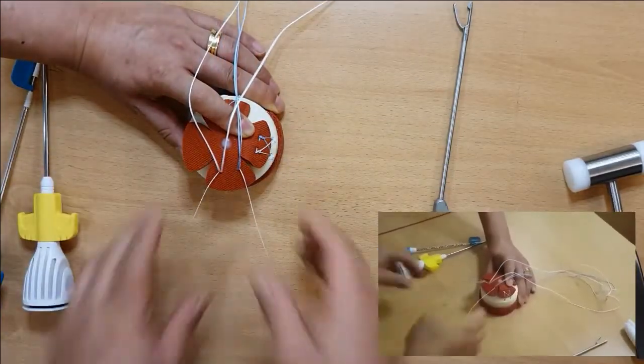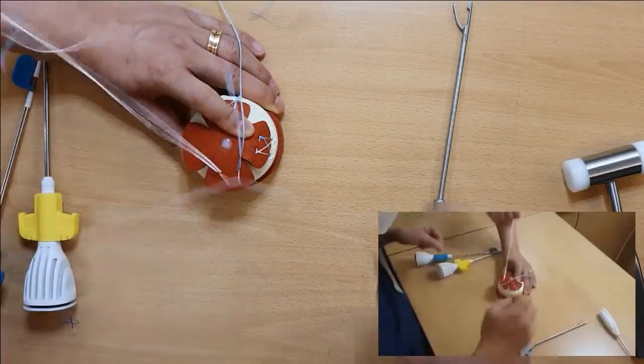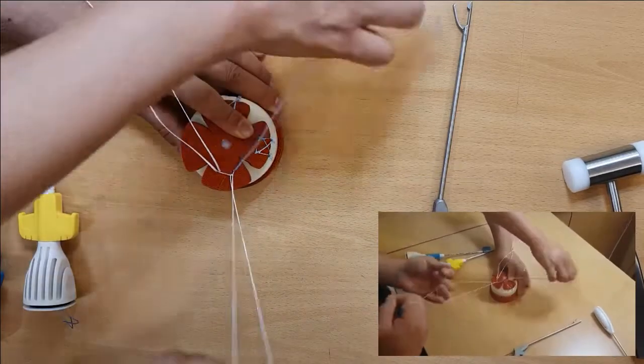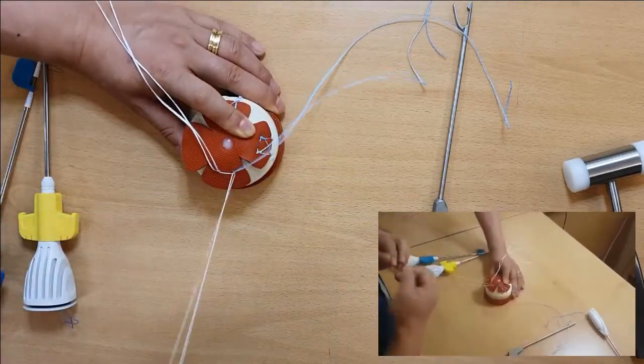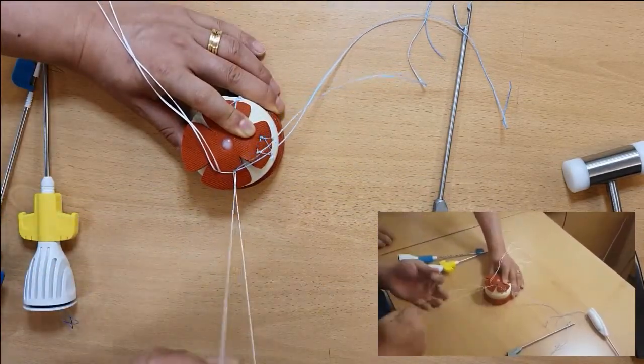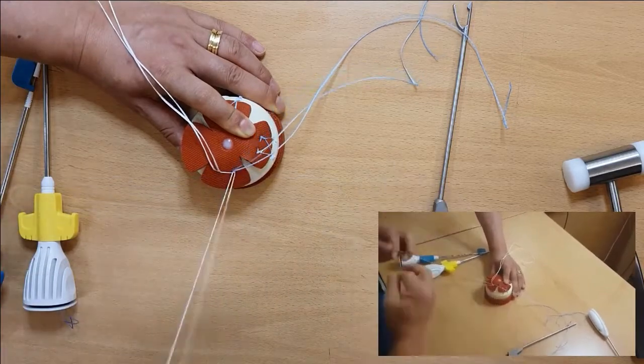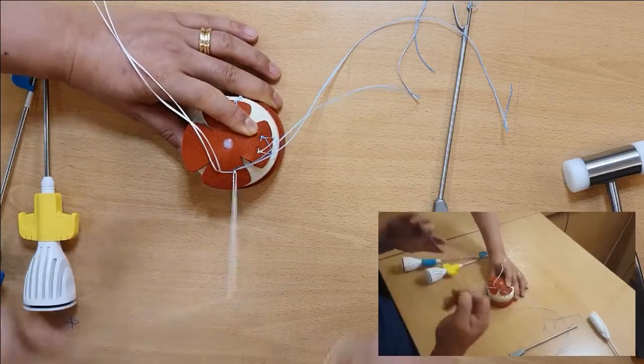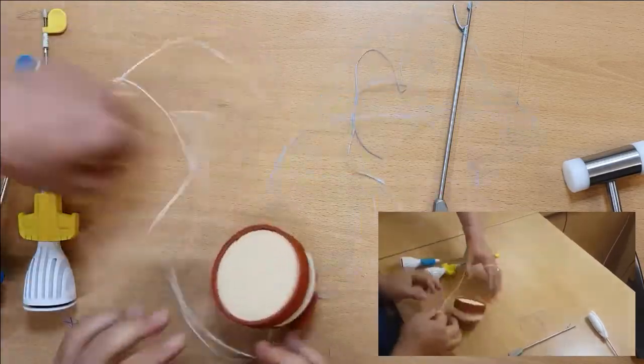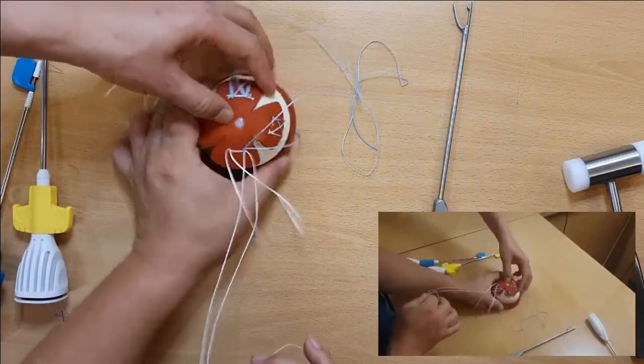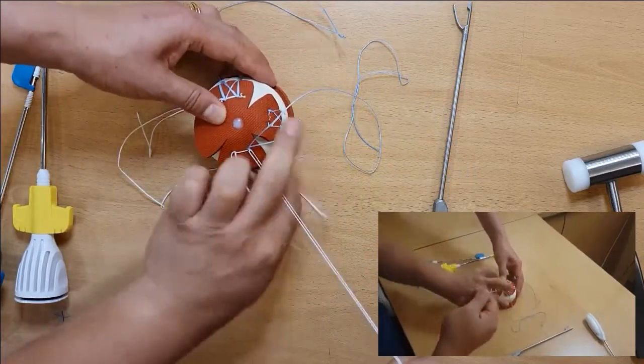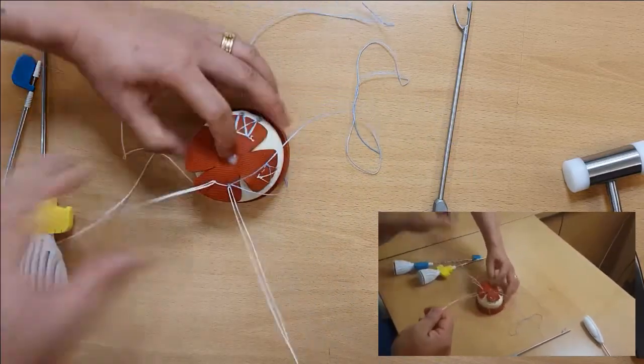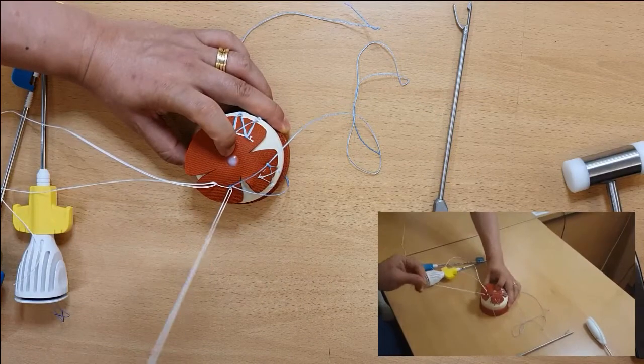Now grab these two fiber wires that you first cast and just tie it. Since we have the extra fiber wires, I can always just tie it up on the medial side. I'm going to cut it.